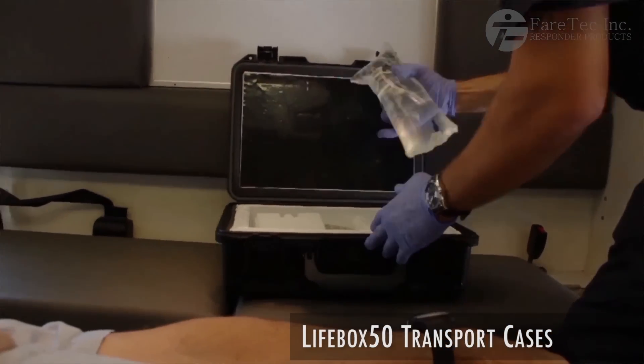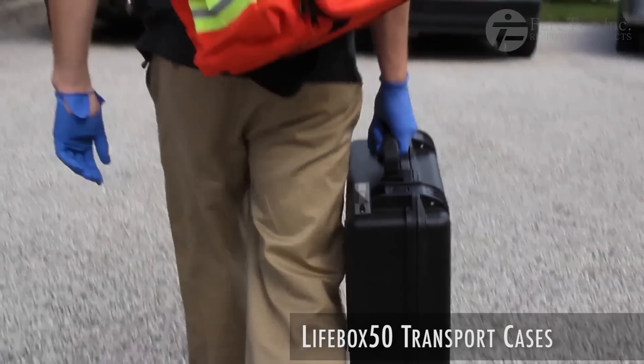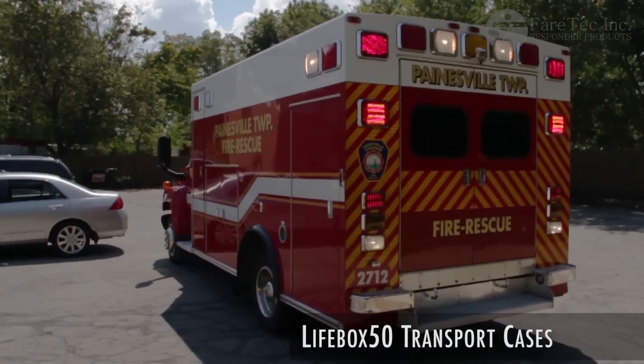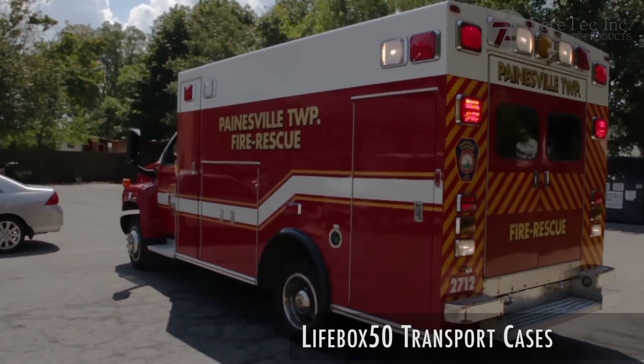The Lifebox 50 doesn't require electricity, so a responder is not limited by their proximity to a power supply. Powered units can drastically drain a vehicle's battery.